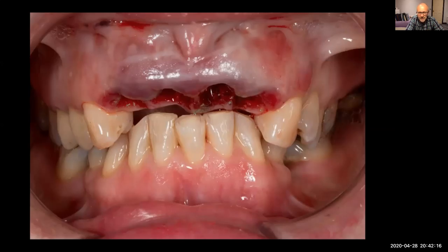Here we are. I've taken the teeth out carefully. Now notice there's very little space there when she's biting together. The denture has to be thickened up in that area with acrylic, so we do open the bite up a little bit. That is just something that we have to do in these circumstances, particularly with a deep overbite like this, class 2, division 2.